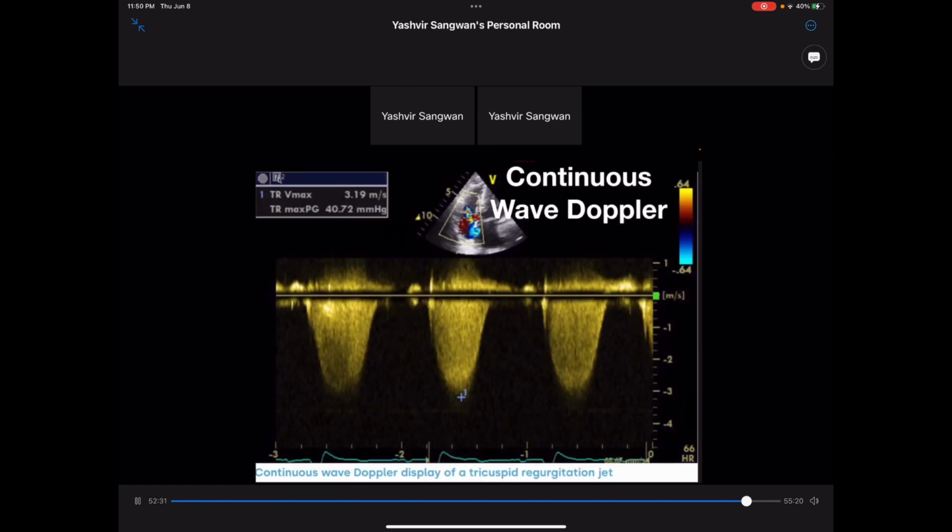The last thing is continuous wave Doppler. And the benefit of continuous wave Doppler is that it does not have the aliasing effect. Here what is happening is very interesting. You choose a line, you can put the line anywhere. So you choose the line, and now there are two crystals. One crystal is continuously firing and another crystal beside it is continuously listening for whatever comes back along that line. So anything that is moving along that line, it will register the highest frequency.